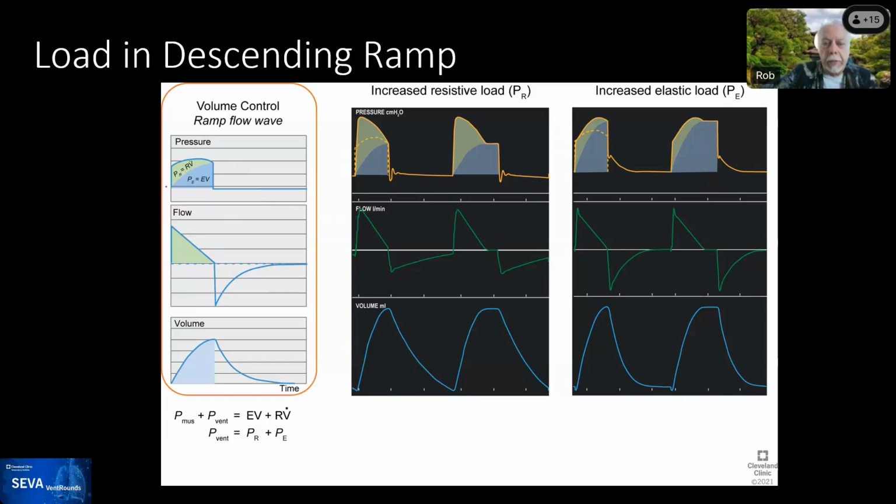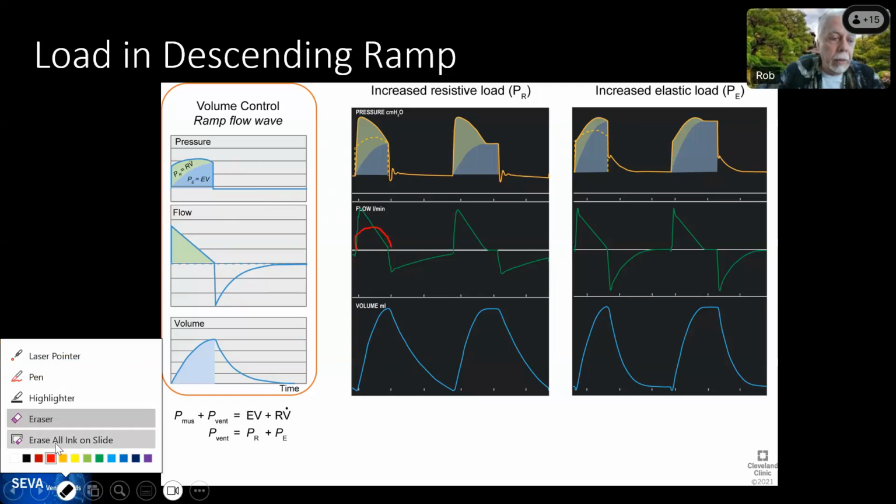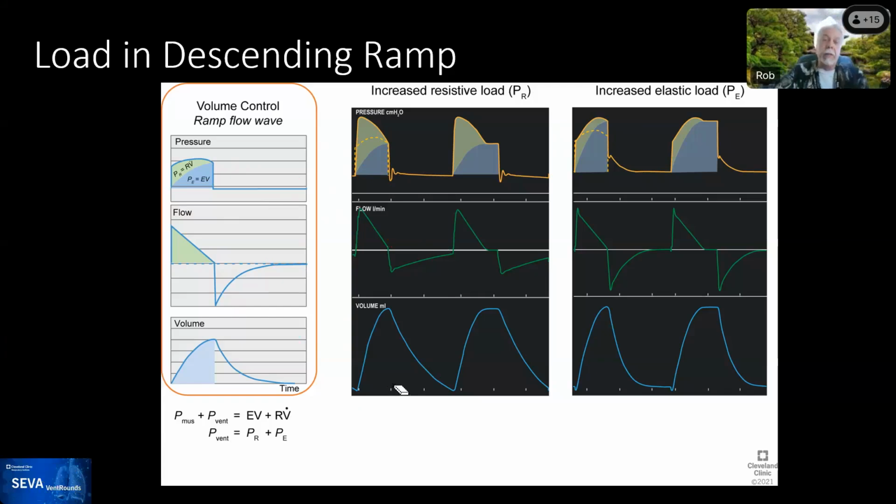There are some ventilators that will allow you to do a sinusoidal waveform like that for inspiratory flow. Not all of them have that. And you could argue that is more physiologic, but I don't know of any evidence that says that that really has any bearing on outcome.